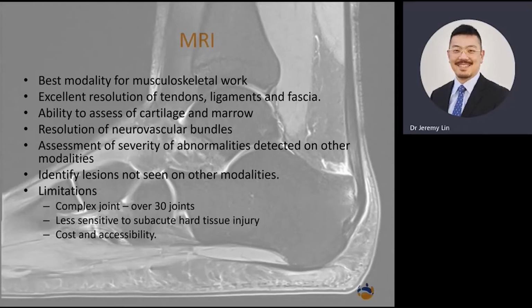The disadvantage of MRI is that because of the way Medicare has been funded, it has the potential to attract more cost for the patient. It takes longer for the images to be acquired, and the patient has to be able to stay still inside the magnet. The other thing is that patients are often concerned about the noise and also the claustrophobia related to going into a tube. The good thing about MRI around the ankle is that their head and most of their upper torso stays outside the tube, so claustrophobia is less of an issue.